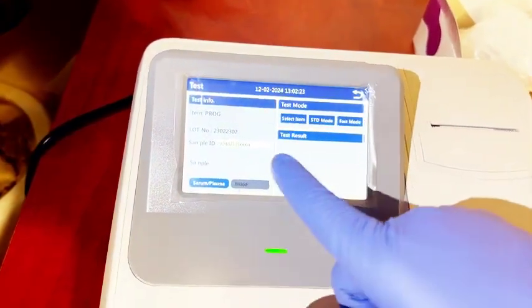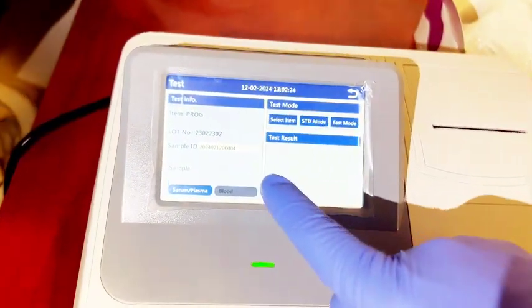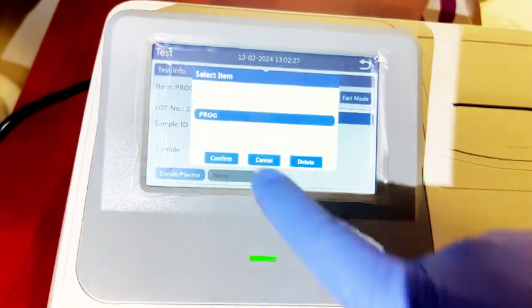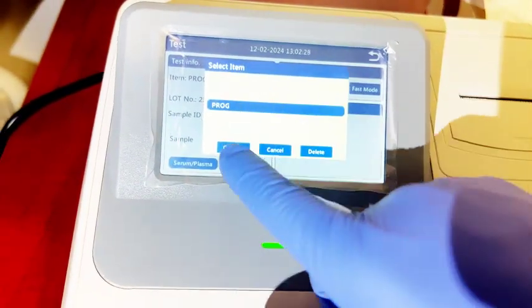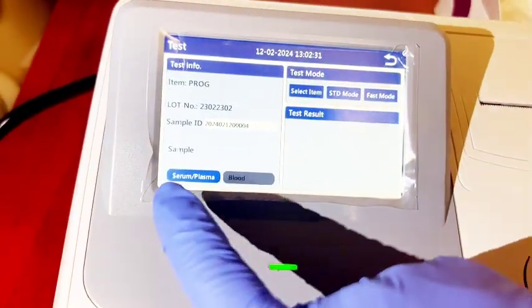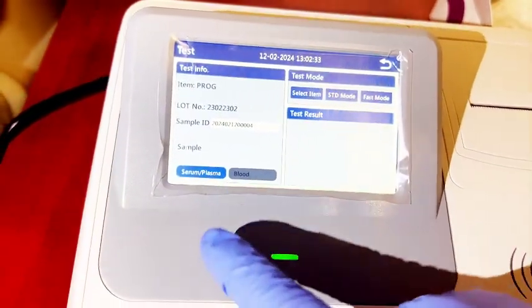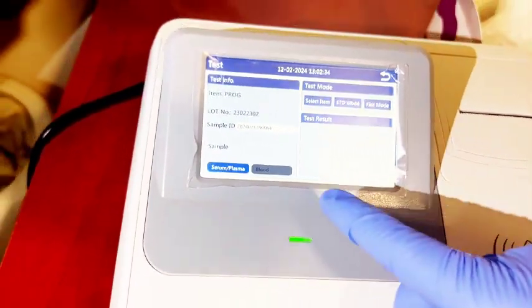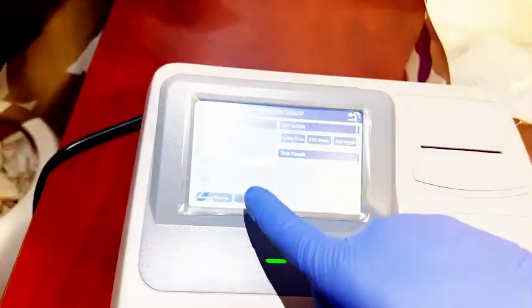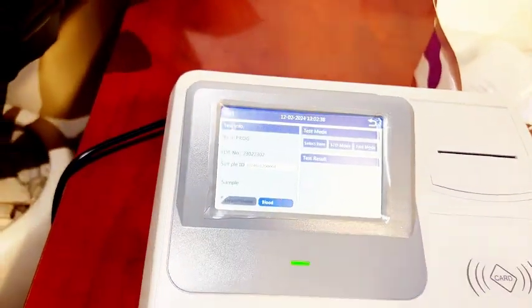The test we are about to run is Progesterone. Select Item, click on Progesterone, then confirm. We have serum or plasma and whole blood as options. The sample we have on hand is whole blood, so you select whole blood.